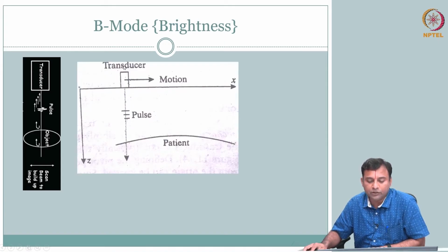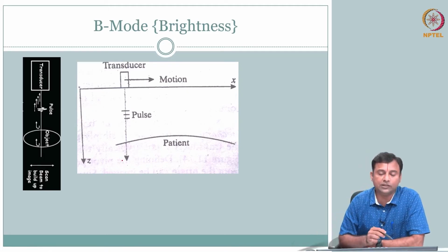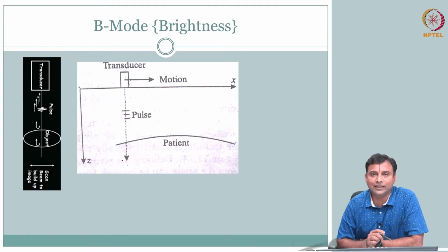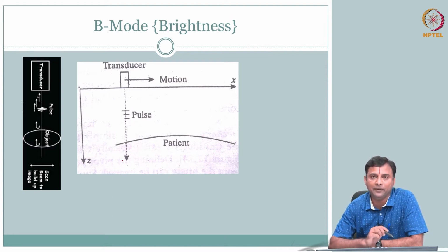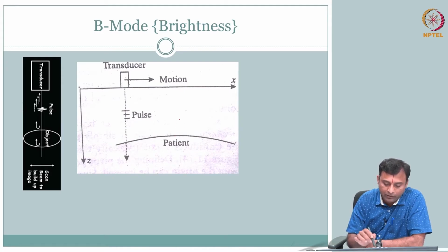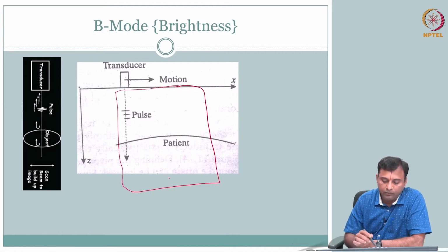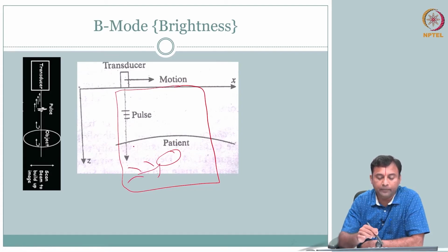So, I move the transducer. So, this is the pulse, right. For simplicity, this is what we put, but notice the challenge. If I want to do the scanning, this is how they used to do it at the beginning. You have a transducer, how do I move this correctly so that it is registered, so I can get an image, right. So, your image, as you see, can be like this. Some organ is here, baby is here, for example. This is the image that you are building.